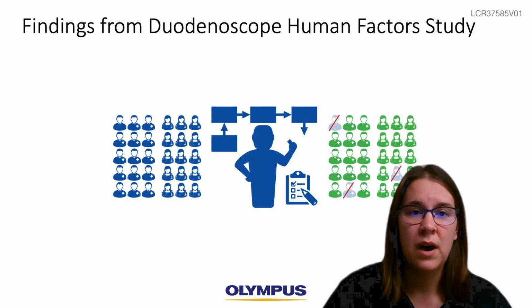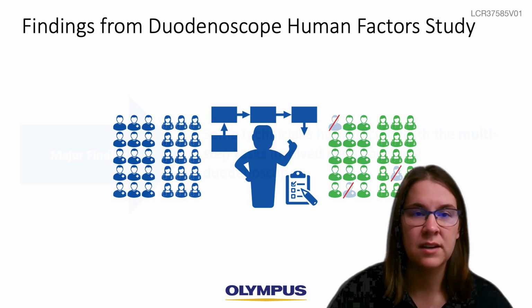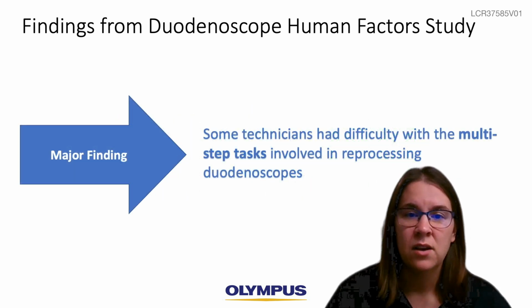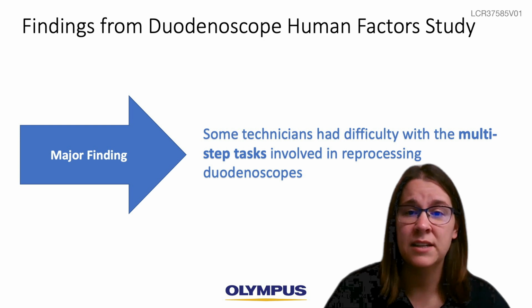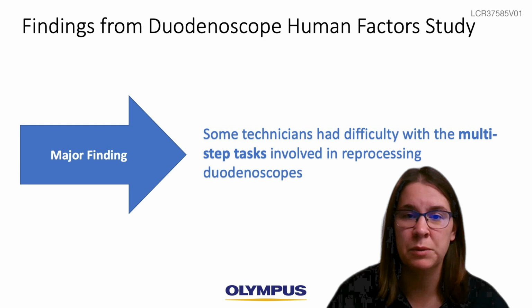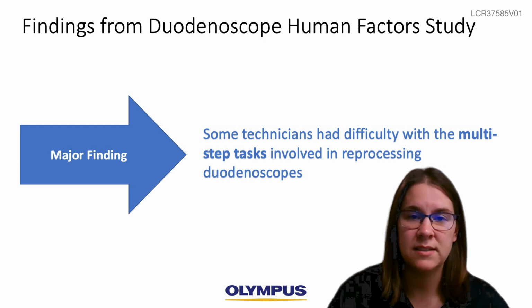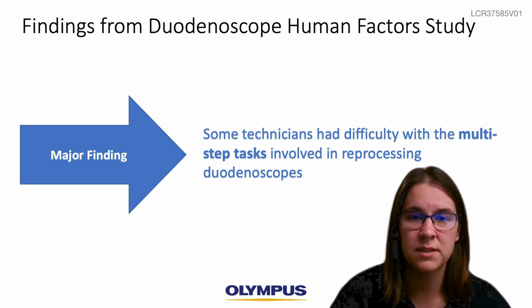Now we'll review two high-level findings from our Olympus duodenoscope human factors study. The first major finding was that some technicians had difficulty with any multi-step tasks that are involved in reprocessing duodenoscopes. An example of a multi-step task is during pre-cleaning when the technician needs to be aspirating water or detergent while at the same time raising and lowering the forceps elevator for a defined number of times.